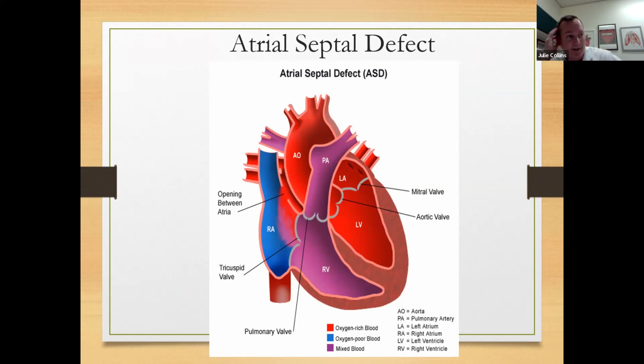So we put the kid on pump. The surgeon reached in through the tricuspid valve with forceps and pulled out a very large device. I think the largest device they actually make. That shows you how large an ostium secundum defect that was. Maybe that kid shouldn't have gone to the cath lab in the first place. That probably should have been a surgical patient right off the bat. Okay, so that's the secundum.